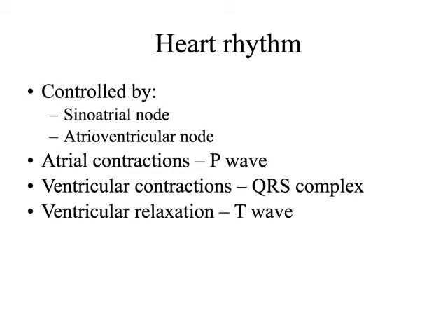Then it actually is watching how the person's breathing and stopping the radiation treatment, right? And then waiting for that breathing to relax and then starting it again, right? So it is real time.